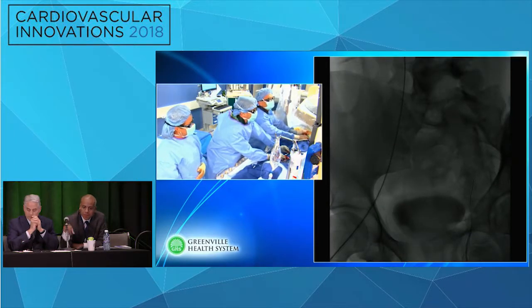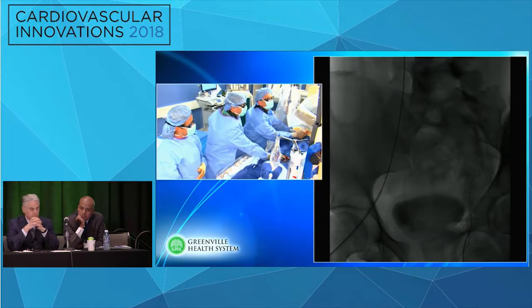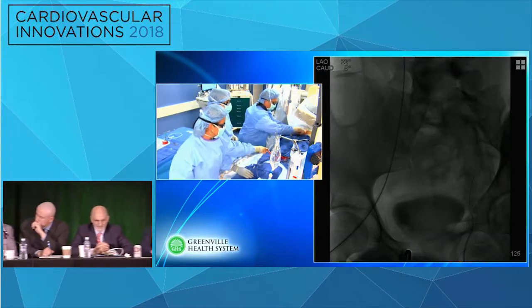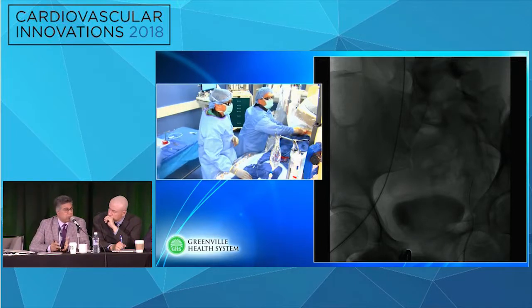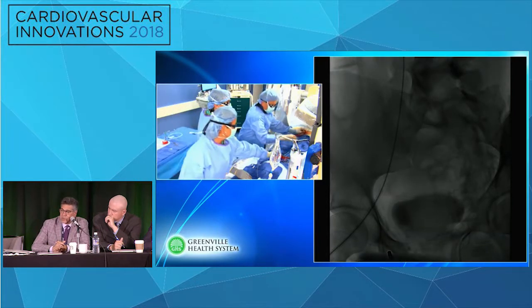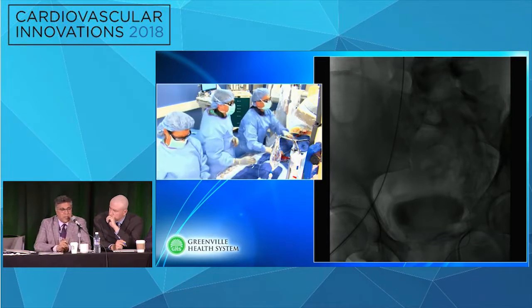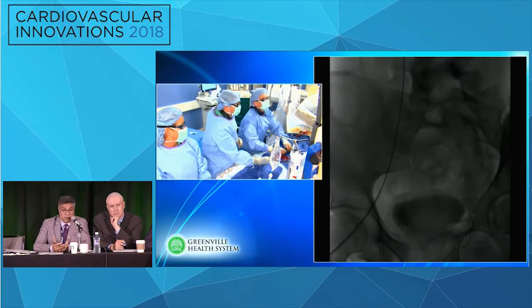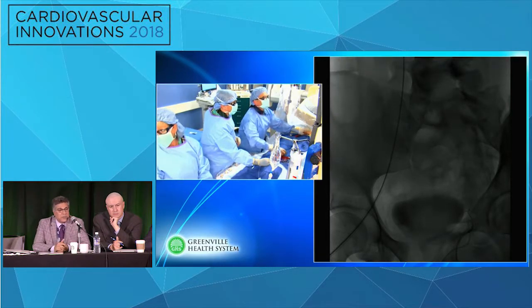Tony, if you had imaging, would you have planned differently here? I think that anything that allows you to understand where the confluence is helpful, right? So whether it's registration of MRV or whether it's CT and overlap, knowing where the target is from some way of imaging is going to be much better than trying to do it blindly. And I think, Bruce, you showed very nicely how smooth that contralateral side is. It's not going to be a feel thing. No matter how many different views you go in, it's not going to really show it to you.